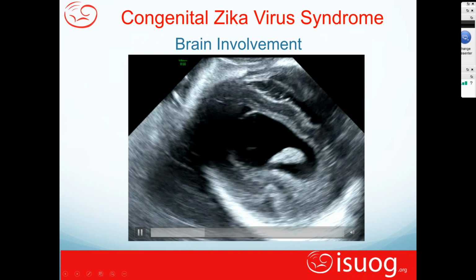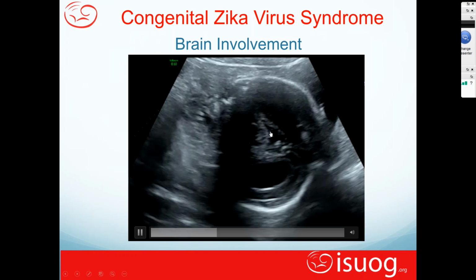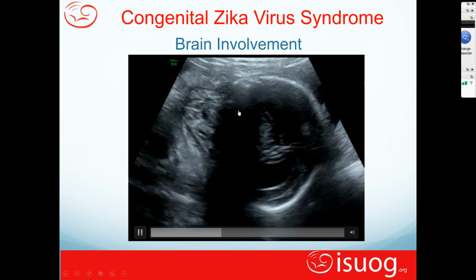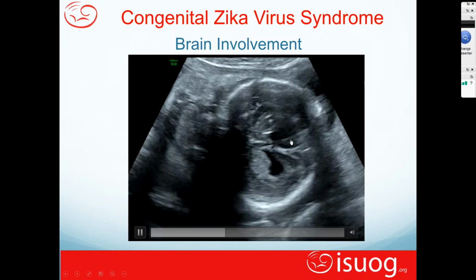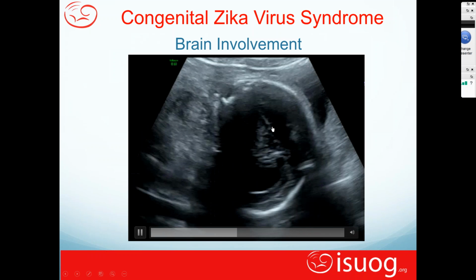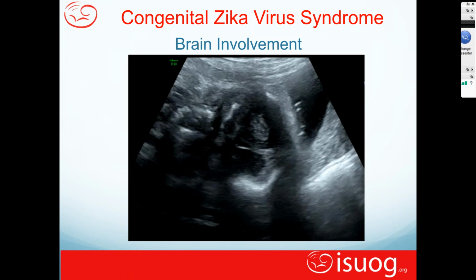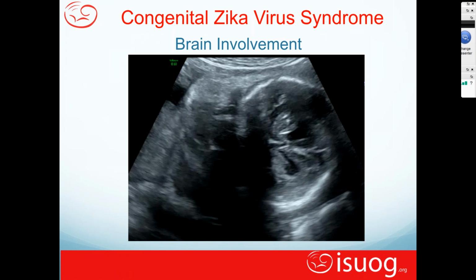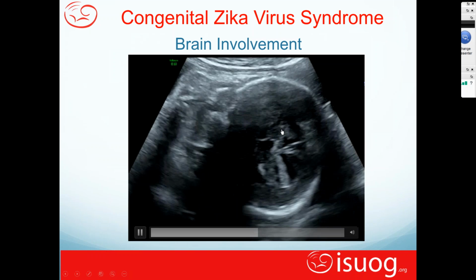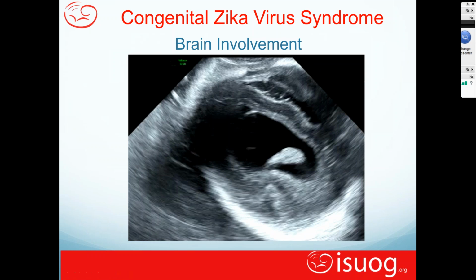Another case of ventriculomegaly and the calcifications that we're clearly seeing here in all areas of the brain. There you go there as well in these cases. So looking carefully, looking for the subtle changes to calcifications is another clue that may be the first one that you see before you see the ventriculomegaly. It doesn't necessarily come one after the other or proceed accordingly.